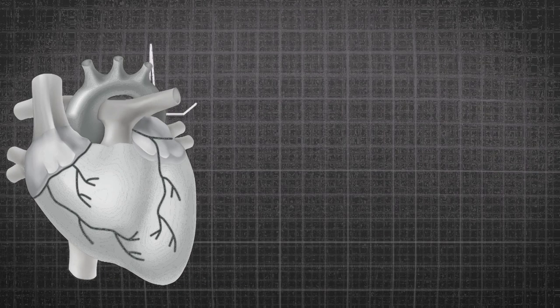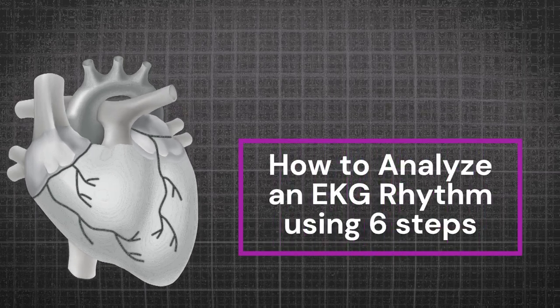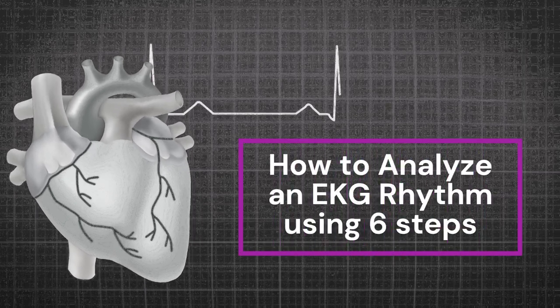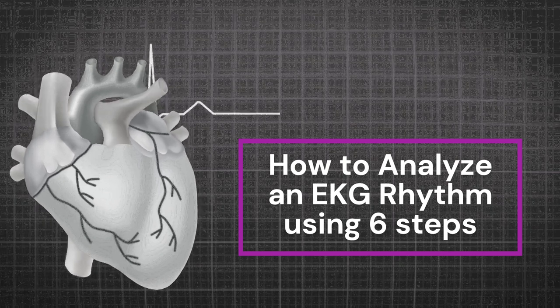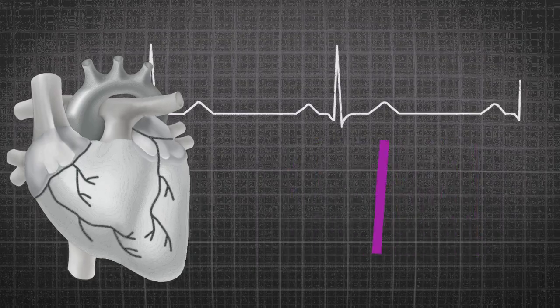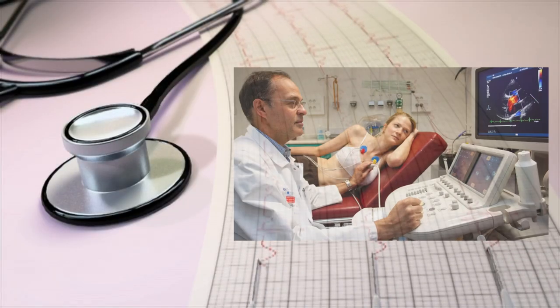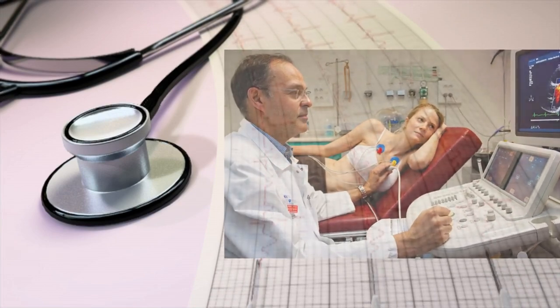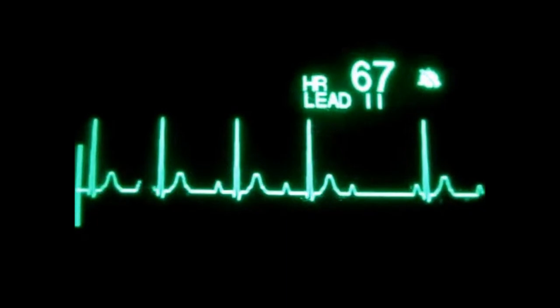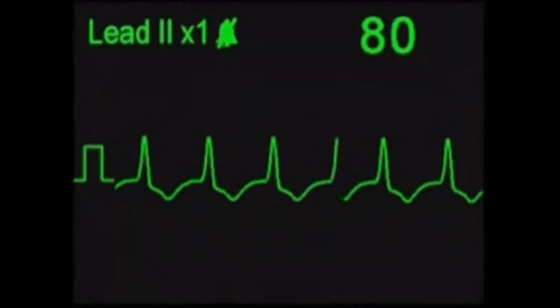Hello and welcome to our video tutorial on how to analyze an EKG rhythm in 6 simple steps. An EKG, or ECG electrocardiogram, is a non-invasive test that measures the electrical activity of the heart. Analyzing an EKG rhythm is an important skill for healthcare professionals, as it can help diagnose various cardiac conditions. In this video, we will be discussing 6 steps to help you analyze an EKG rhythm.